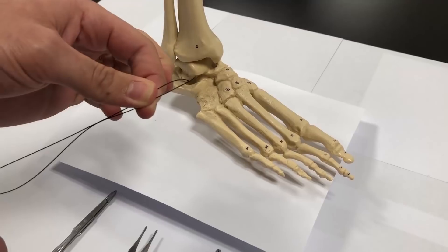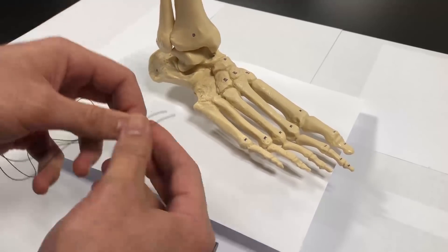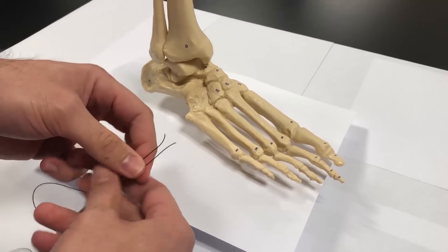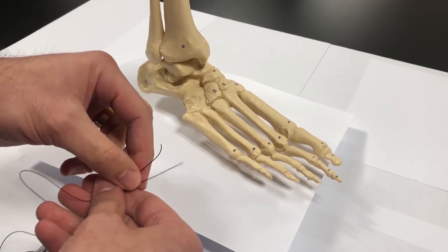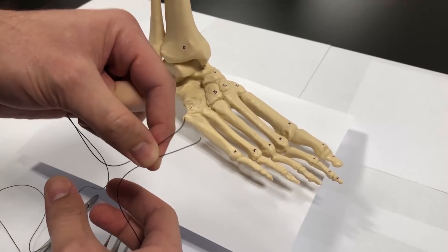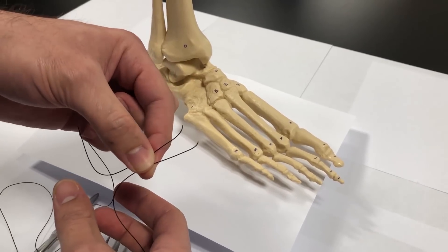Alright, so now I'm going to show the technique. I'm going to do this example for a fifth metatarsal shaft fracture. After you've done your dissection, revealed the fracture, cleaned out the site, and you're ready to reduce, you take your suture. What I have here is nylon, but I would recommend using a 2-0 or a 3-0 fiber wire.